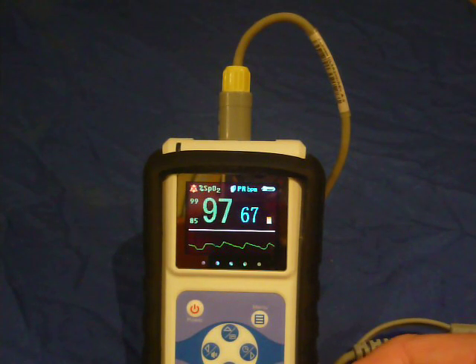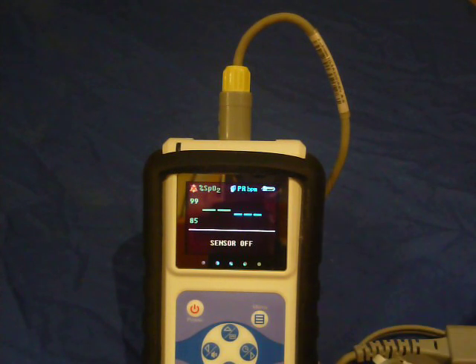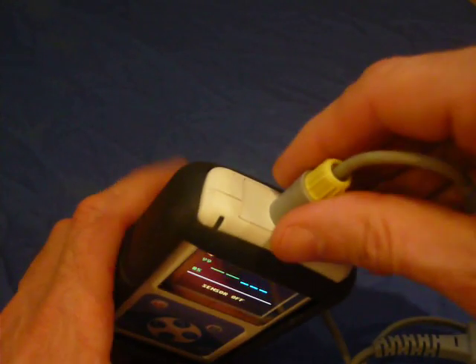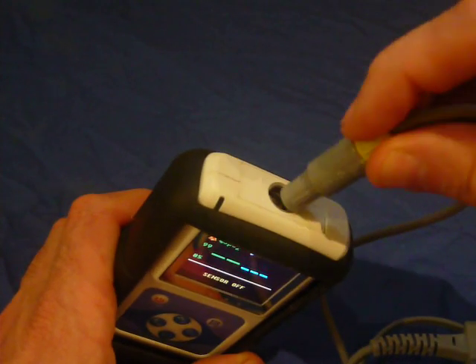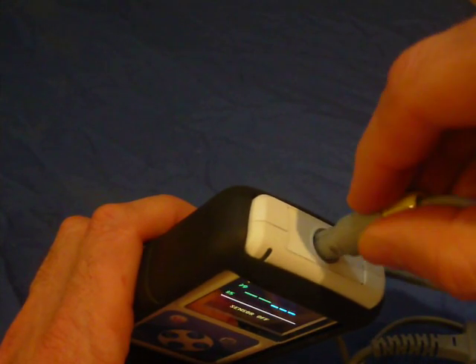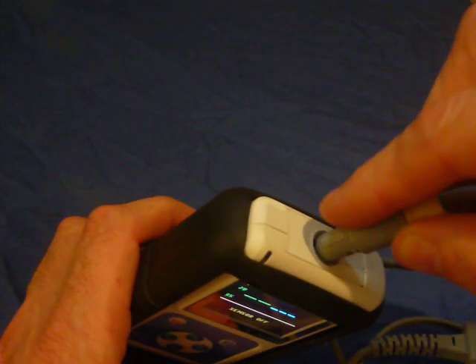Most problems occur with the pulse oximeter cable and connector. We have had two issues where the connector was jammed. If this happens, try to rotate the cable connector until the key is pointing left, and then the probe cable will be able to be removed.